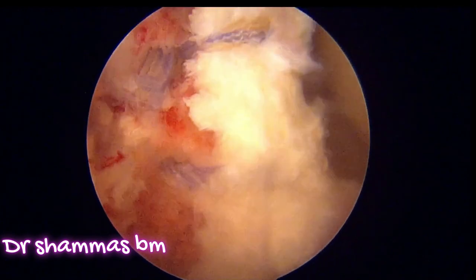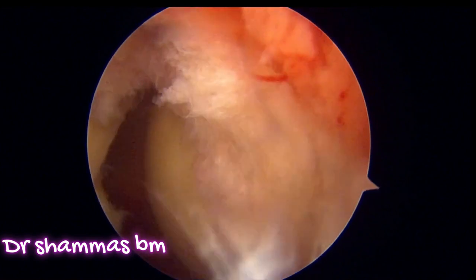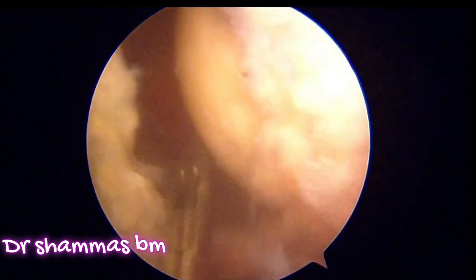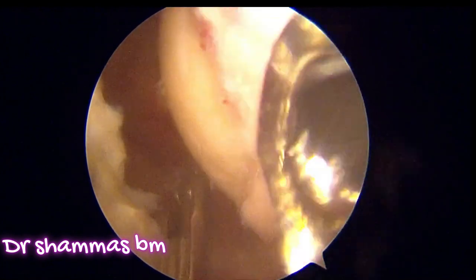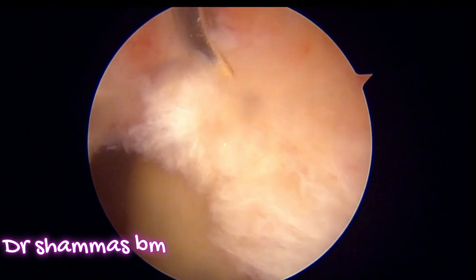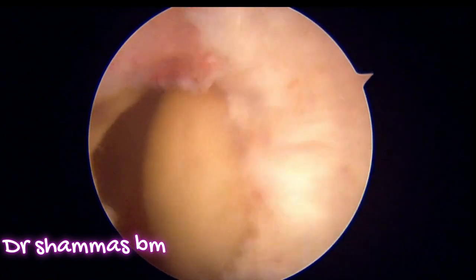The second part of the surgery — suturing and securing the labrum — is now over. The first part was osteochondroplasty, the second part was labral repair. Coming to the third part: we have the capsule with a big rent that we have made during the procedure. One of the complications of this surgery is hip joint subluxation, so you should not leave the capsule open. I am bringing the lasso inside again — what you see is the capsule that was cut — and I am passing the lasso through one side of the capsule.